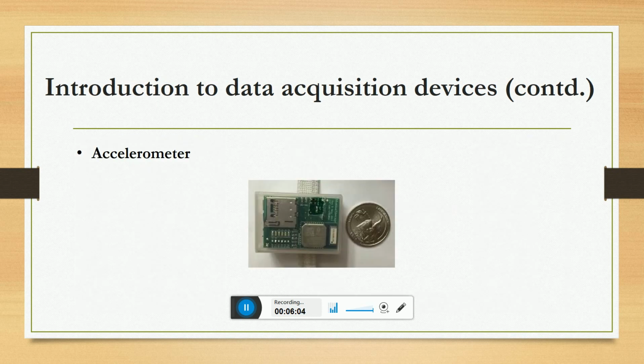Now the accelerometer, the second device which we have used for data collection here, is also known as the inertial sensor, which has been manufactured in the ESSP laboratory of the University of Texas at Dallas. It is made of a MEMS sensor containing 9 axes used to capture X, Y, Z axis acceleration, angular velocity and magnetic strength.